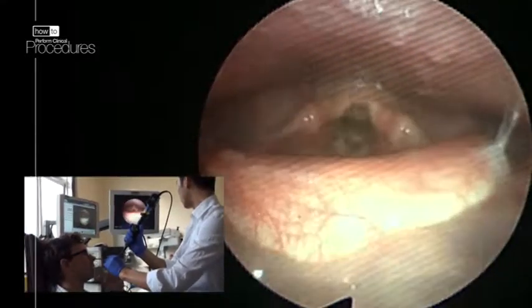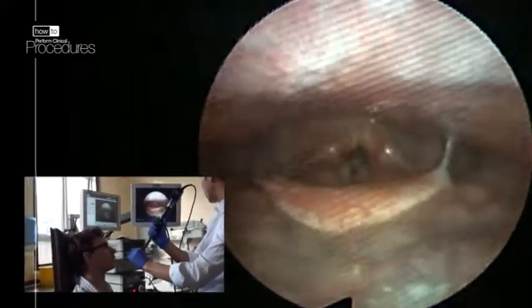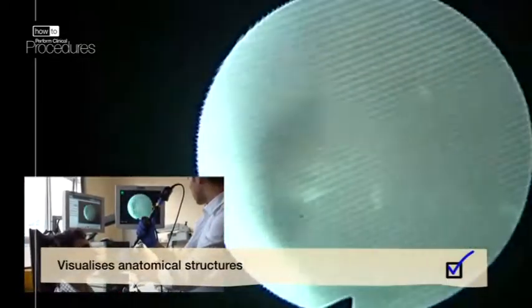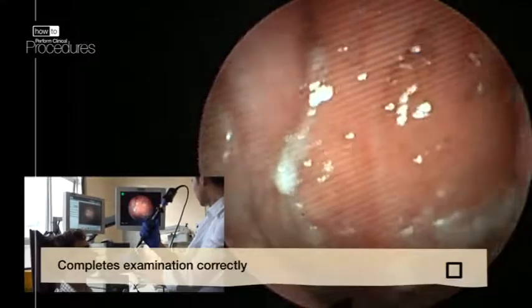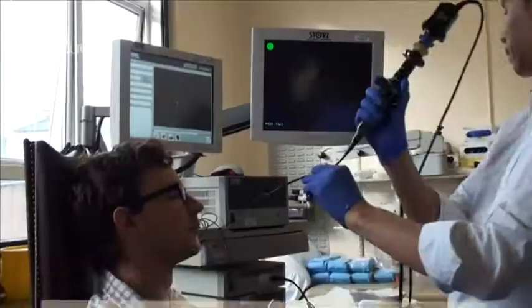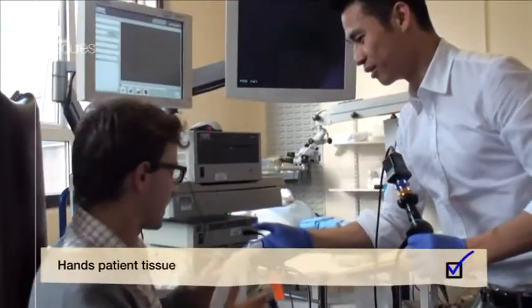When you have finished the examination, carefully remove the scope, having again a close look at the anatomical structures. Give your patient some tissues to wipe their nose.